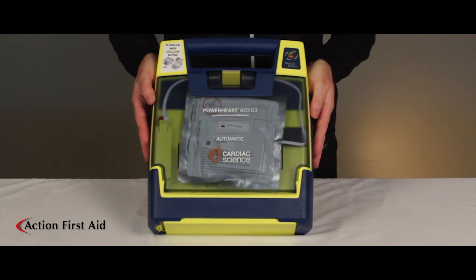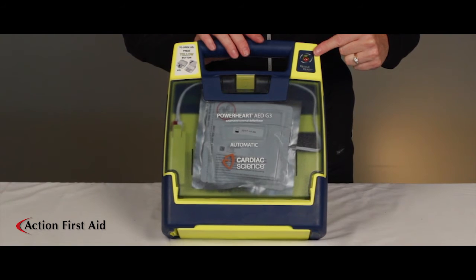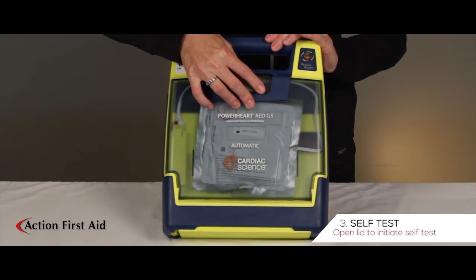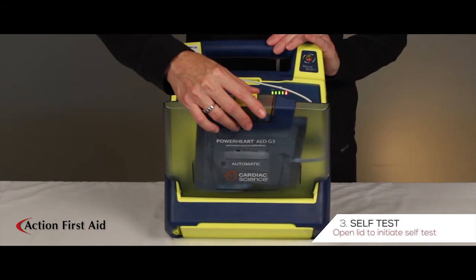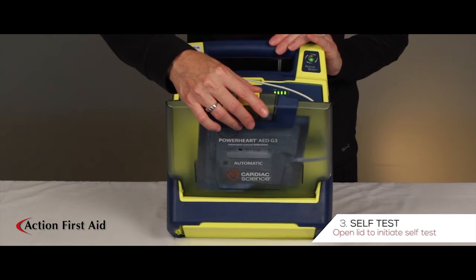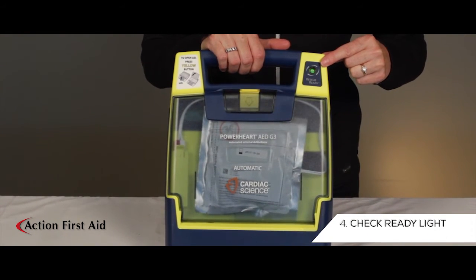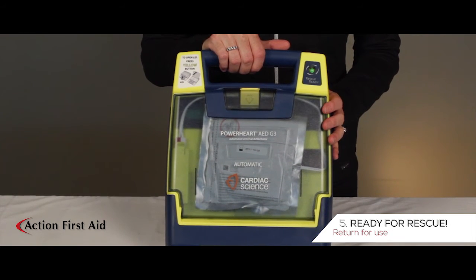The status indicator will continue to show red and the AED will continue to beep until the AED completes a self-test. To initiate self-test, open the lid for approximately five seconds. The status indicator will show solid green when complete. Your AED is now ready for rescue.